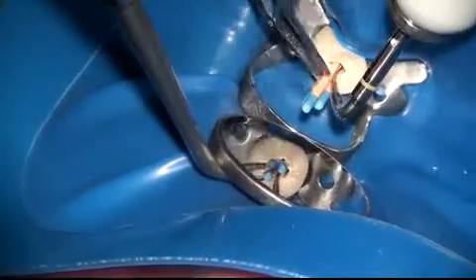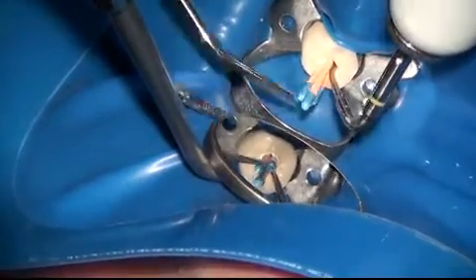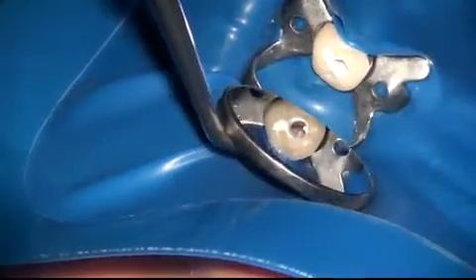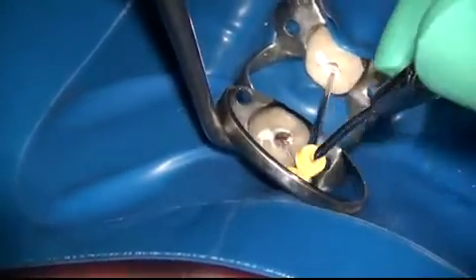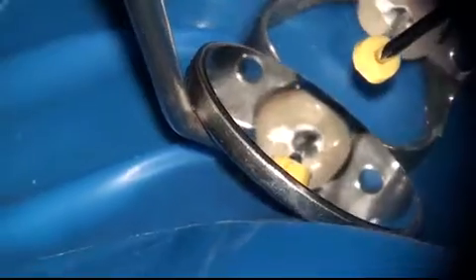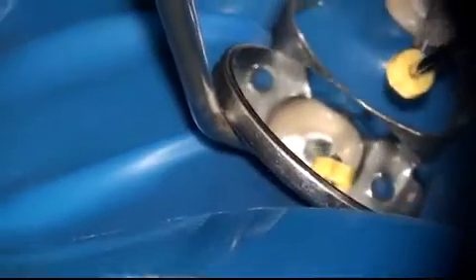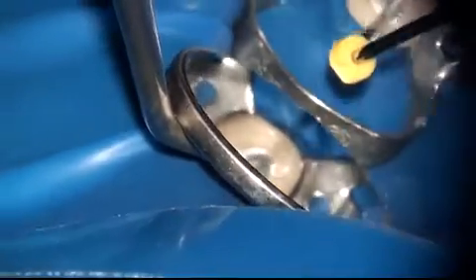The EndoPro 270 is then used to sear off all three cones simultaneously in the mid-root area. A nice little trick is to leave the EndoPro in place and then have your assistant pull out the cones — this prevents any inadvertent pulling out of the cones. Once the gutta-percha has been seared off, a plugger is used to condense the gutta-percha at the mid-root level.